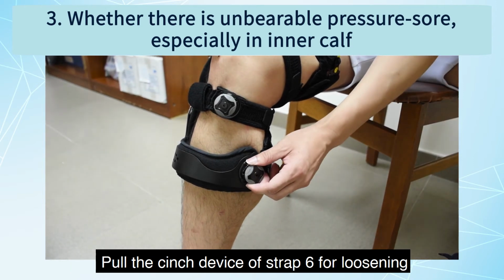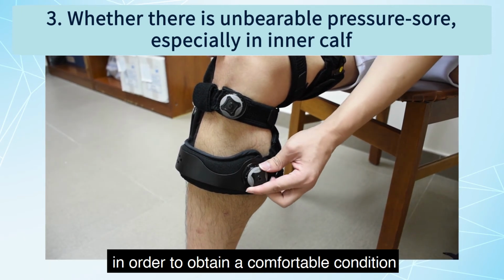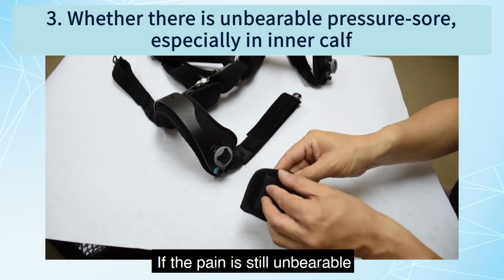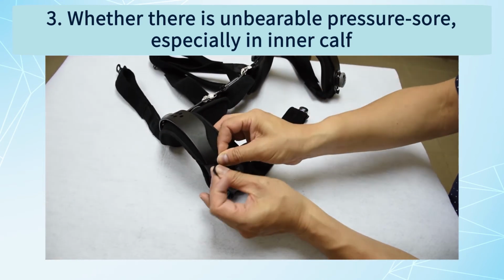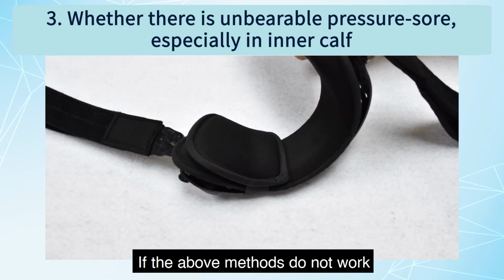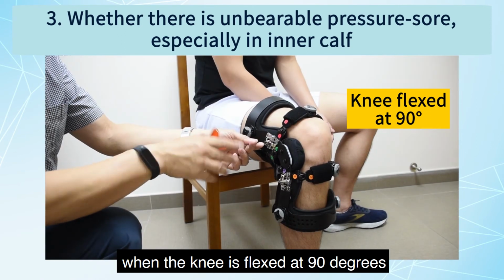Pull the cinch device of strap 6 for loosening. Press again and turn to fine-tune the tightness of this strap in order to obtain a comfortable condition. If the pain is still unbearable, then add a cushion as shown. If both methods do not work, the therapist can decrease the valgus force slightly when the knee is flexed at 90 degrees.